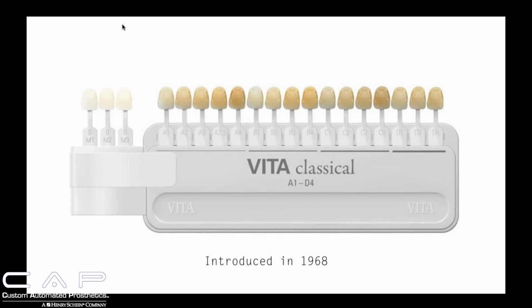But if you think about that, we've been using the same standard for shade taking for 50 plus or minus years, and with all the advancements in dental technology, you would think that as far as shade guides in general, we would have developed a new way of taking shades, and I think that that's well underway now. I know there's been a lot of programs and special cameras throughout the years that are supposed to assist in picking a shade, and I think some of them work very well, but I don't think any of them are a complete answer or a complete solution to picking an accurate shade.